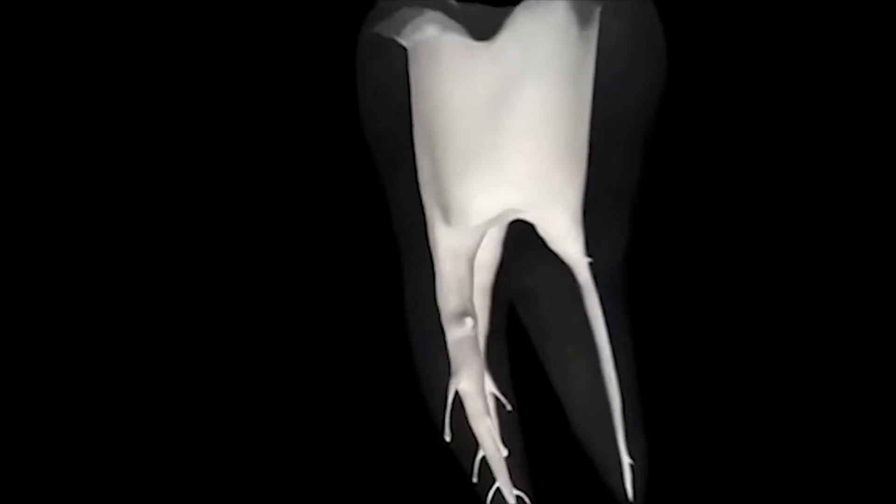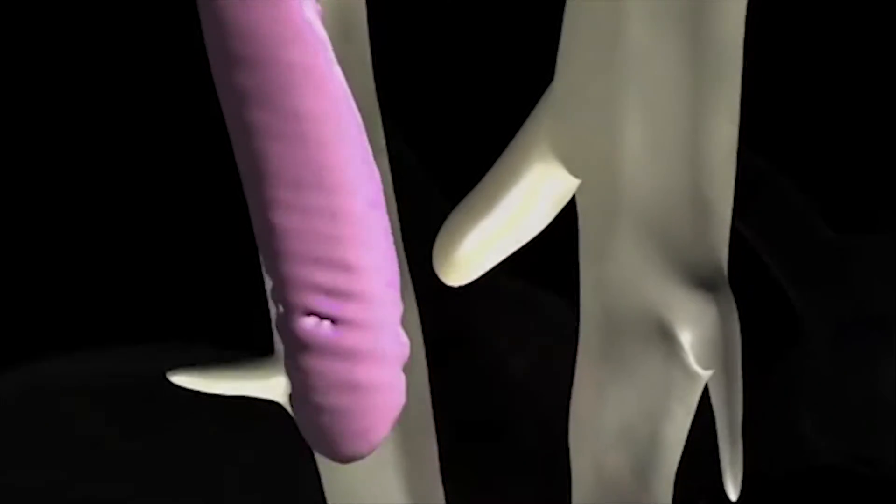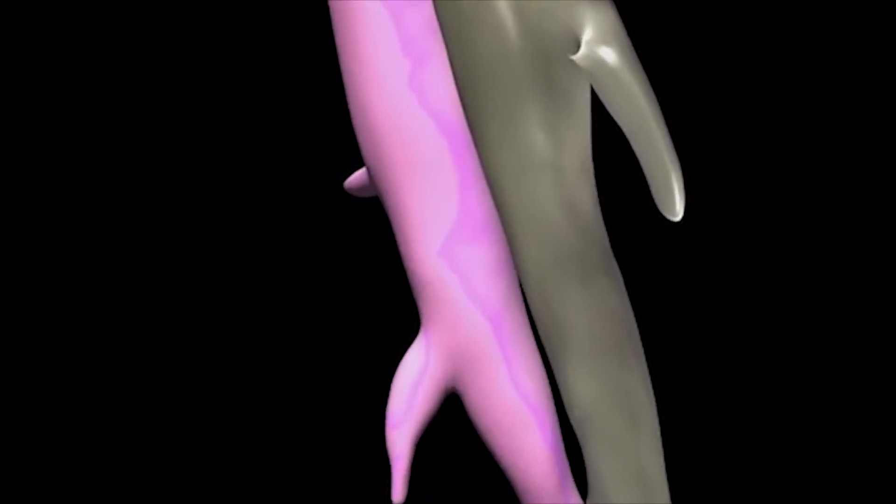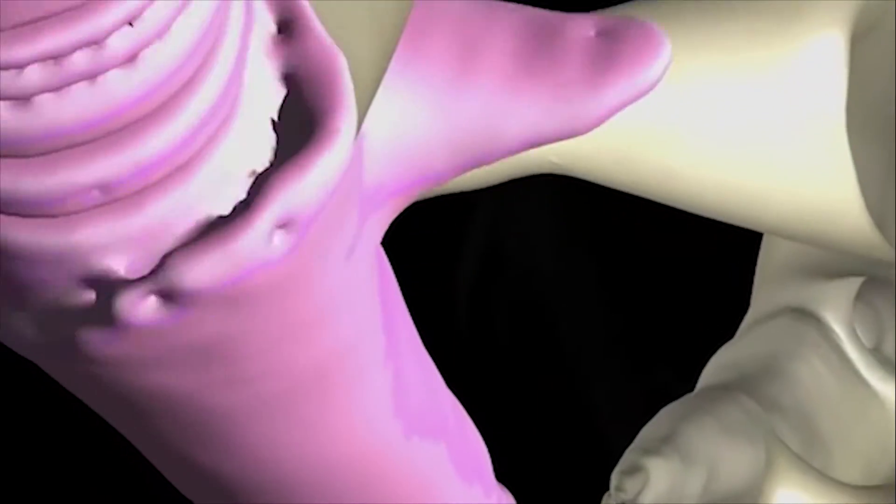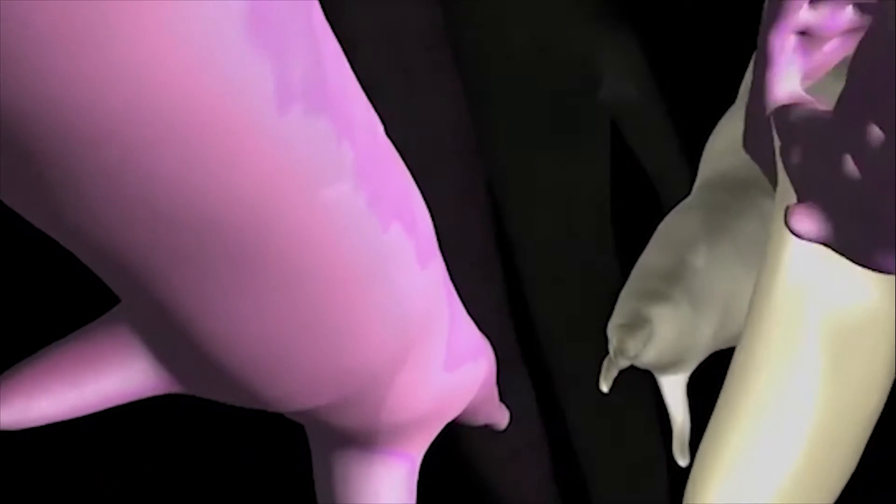Place GuttaCore into the root canal system in one smooth motion without excessive force. The cross-linked gutta-percha core centrally compacts the alpha-phase gutta-percha with a hydraulic force that sends it flowing in three dimensions into laterals, isthmuses, and accessory canals.